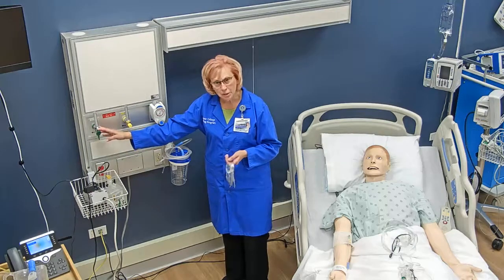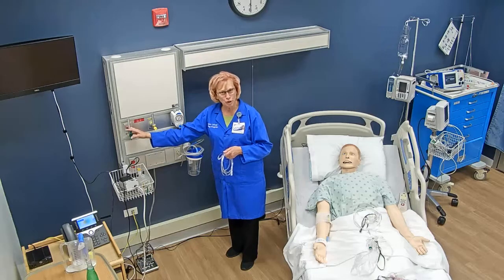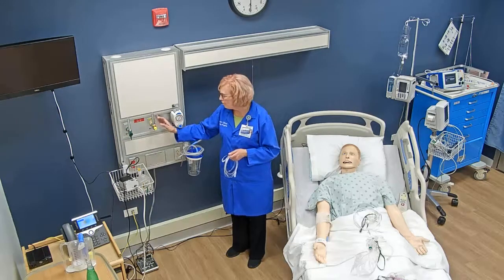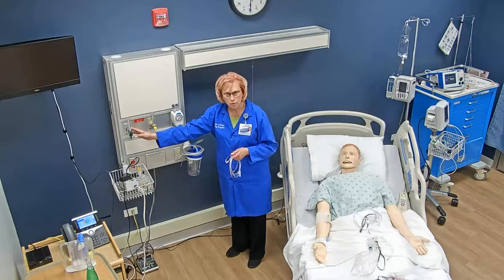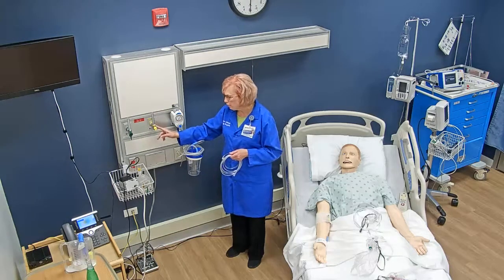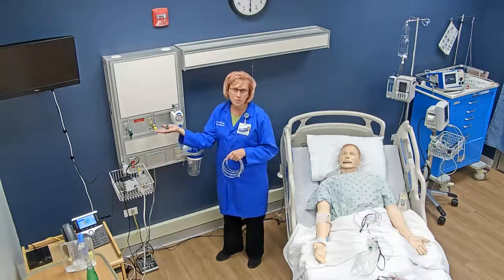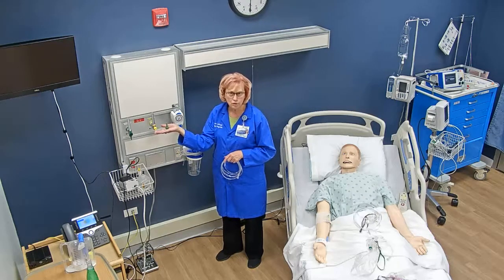Here at Harper Hospital, we don't have 100% oxygen flowing through the facility, so for demonstration purposes we use a yellow flow meter labeled medical air — you will not see this at the hospital; you will use the green flow meter. To hook up the nasal cannula, I start with the flow meter and attach an adapter. Many people call this a Christmas tree because it's shaped like one and it's green — it's the oxygen adapter, and it screws onto your flow meter.